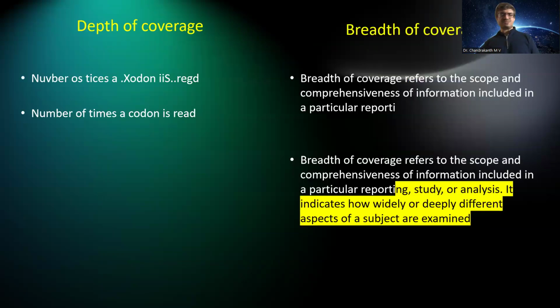What is depth of coverage? If someone asks you to read something, how many times will you read it? It is basically the number of times the sequence is read. You have to read it at least 5 to 6 times. If I read it 100 times, there is a greater chance that I pick up all the material. Depth is the number of times the sequence is read.